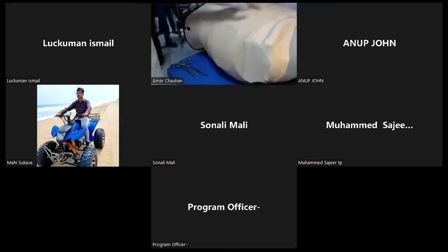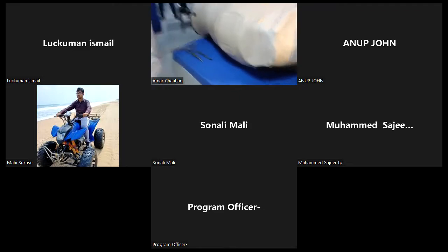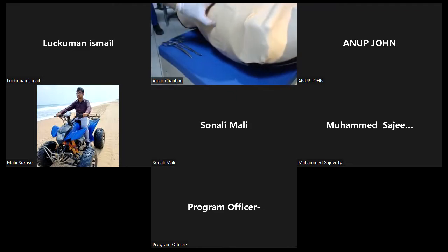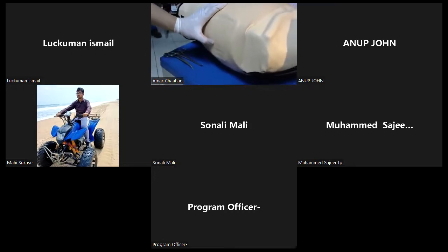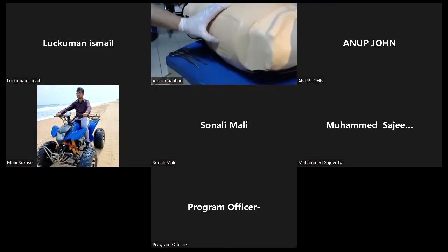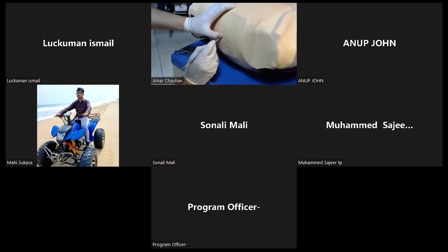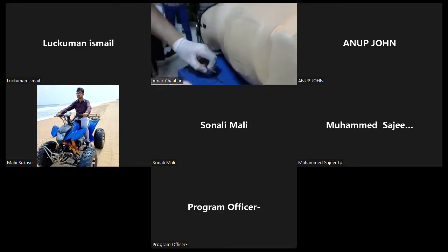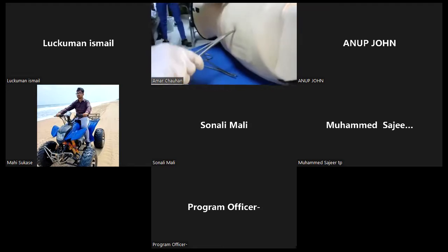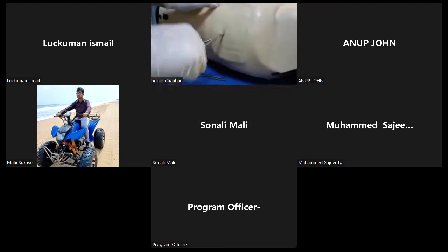Again, we will go in the fifth space. This is the sternal angle. We have given two spaces to practice, fourth and fifth. I will be going in the fifth, adhering to the mid-axillary line, at the upper border of the lower rib. Give an approximately 1 inch long incision, dissect and dilate. We have given muscular tissue also.